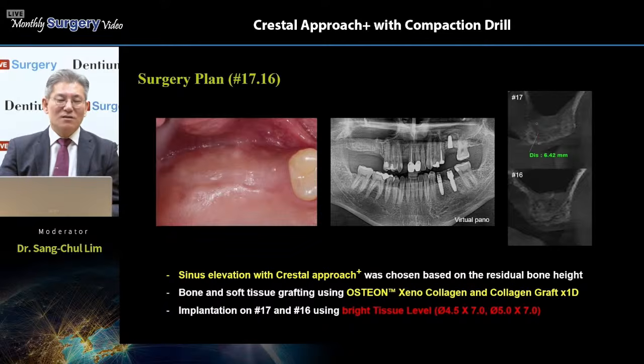Okay, the surgery video shows you more detail about the process and procedure of this Crestal Approach Plus. And what are the benefits, what are the advantages of this procedure? We will also be showing you in today's surgery video. Okay?